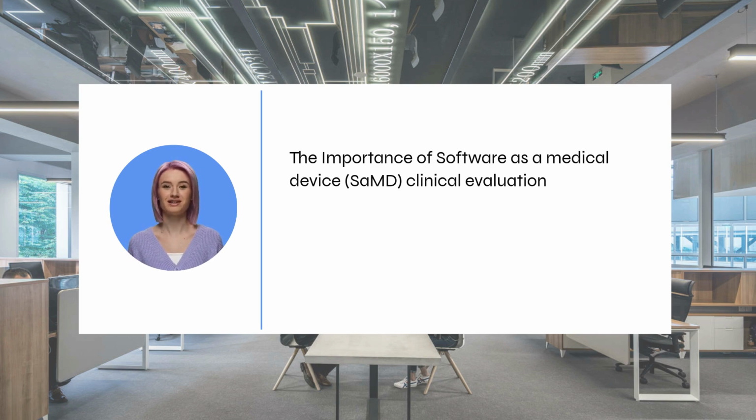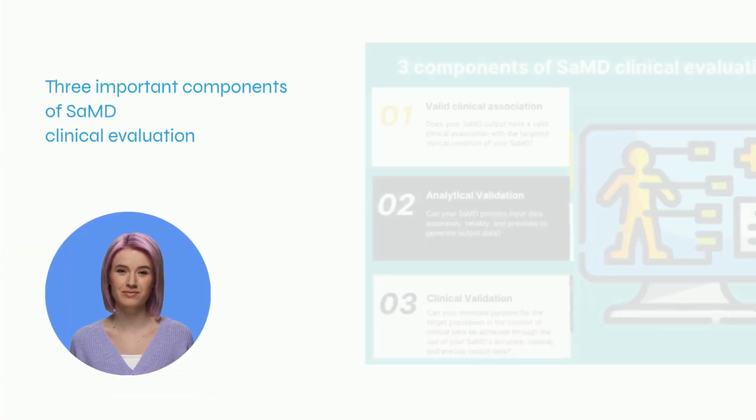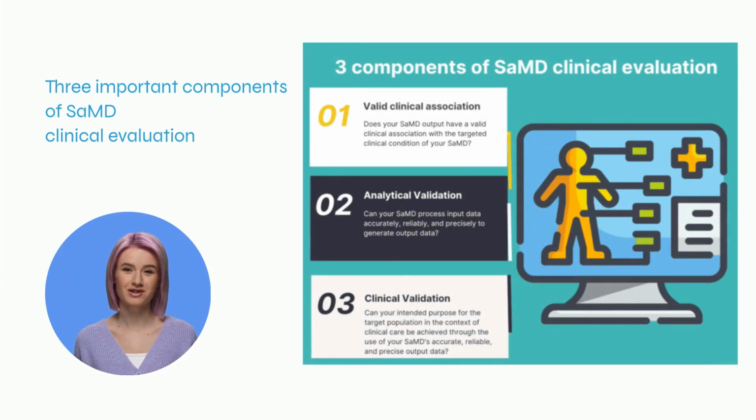SaMD must obtain regulatory approval from agencies like the FDA and EMA before healthcare providers buy it. The regulatory approval process includes clinical evaluation, which is a crucial component of demonstrating the safety and efficacy of the software. Basically, the clinical evaluation of SaMD has mainly three key components.